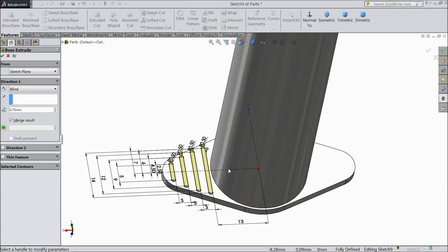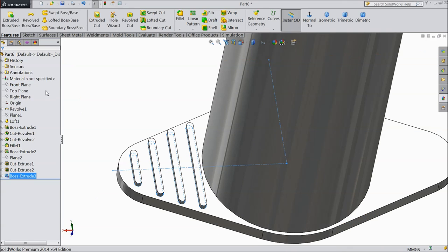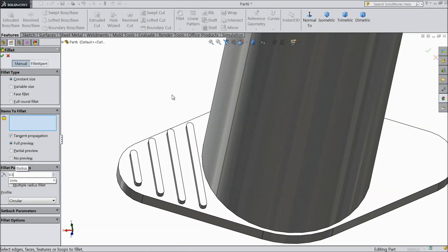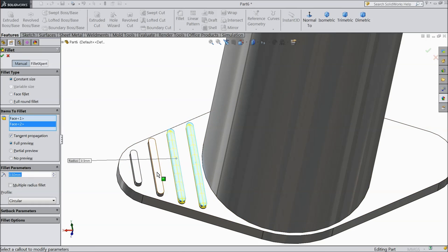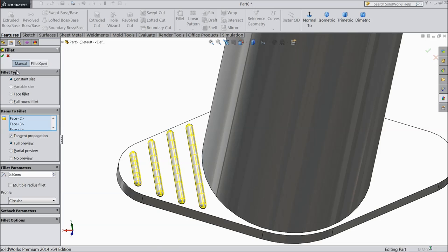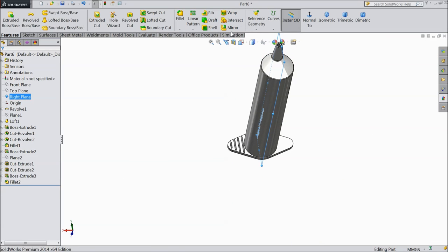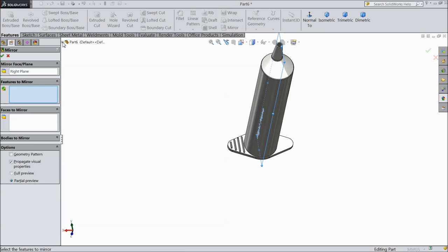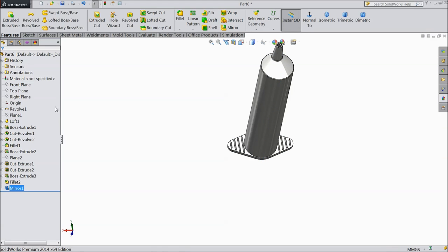Now select extruded boss and extrude up to 0.75mm. Now choose fillet, 0.5mm, select all the faces. Now choose right plane, mirror, and mirror the last two extruded boss and fillet.